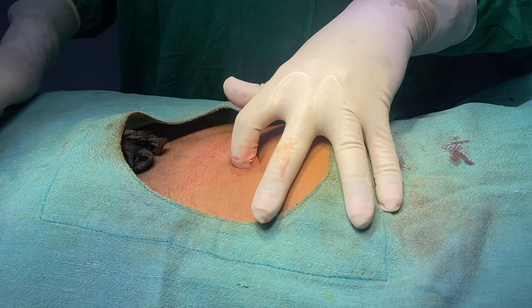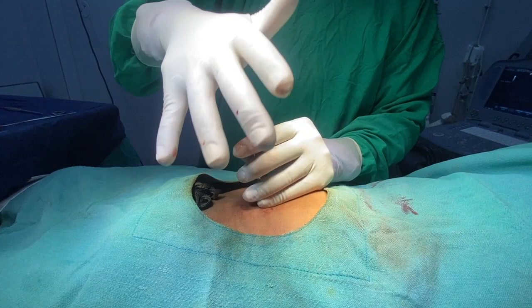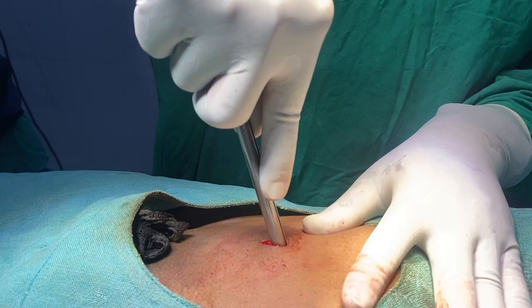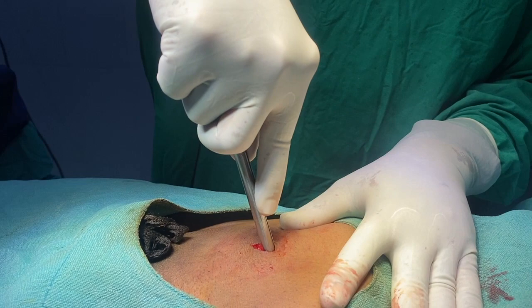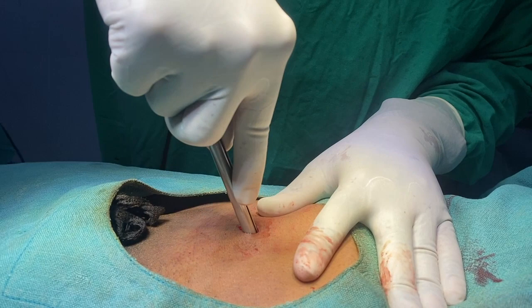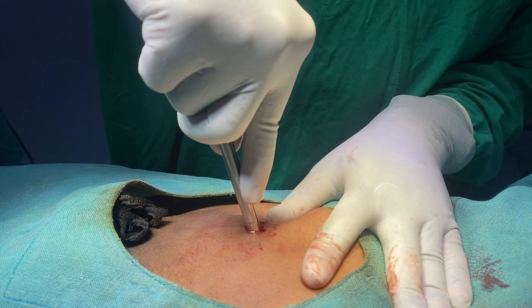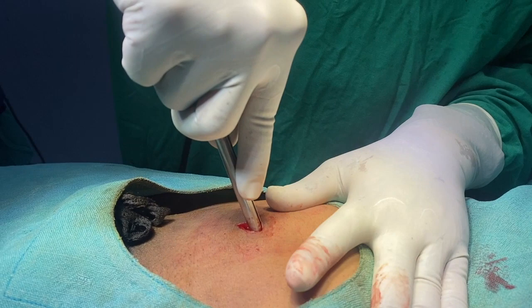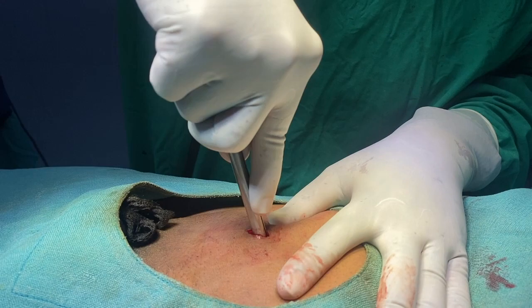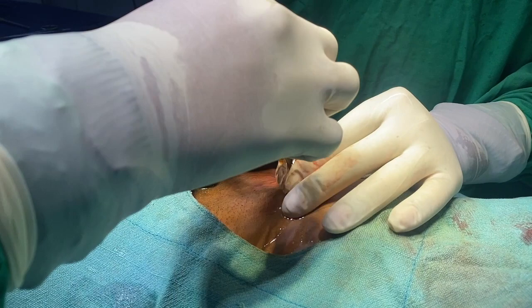Now I place one hand here, palpate the depth and the adequacy of my rectus incision, and through this incision I will put in the trocar. The trocar should be held with the palm and the index finger should act as a guard. Gentle screwing motions will give you an idea about the depth as well as the resistance of the tissues. Once comfortable, try to put it inside with a thrust — the first thrust was not successful, so I increase the resistance on the bladder from this hand and then we are inside the bladder — urine is coming. I remove the trocar and put in the catheter.